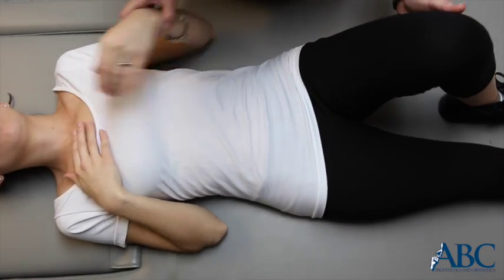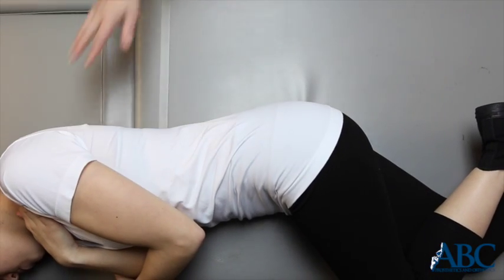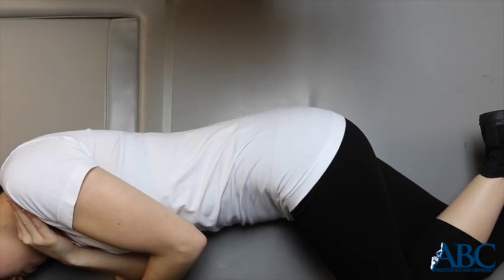Begin with the patient lying supine, or face up, on the bed. Position the back panel of the brace so the tag is facing up. Roll the patient onto their side.